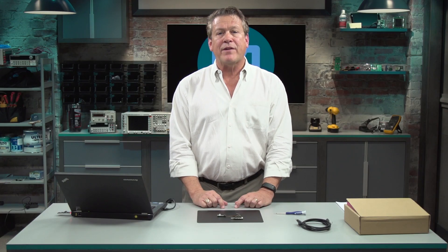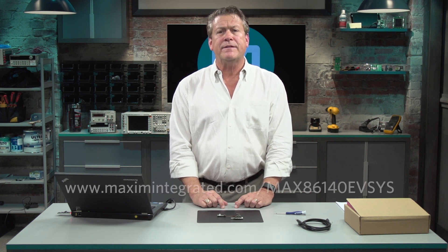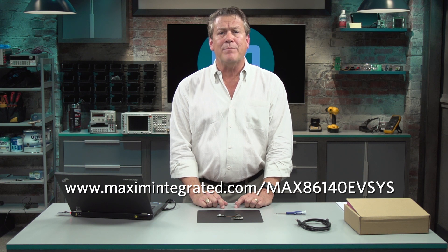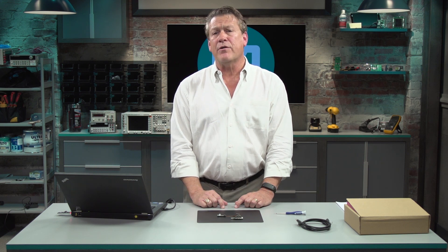That's how the MAX86141 wristband demo unit works. For further information on how to order the EV kit, go to MaximIntegrated.com/MAX86140EVSYS. Firmware, GUI, and EV kit data sheets are available on the website as well. Thank you.